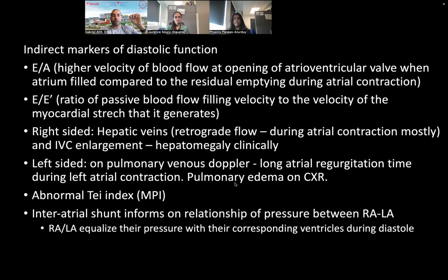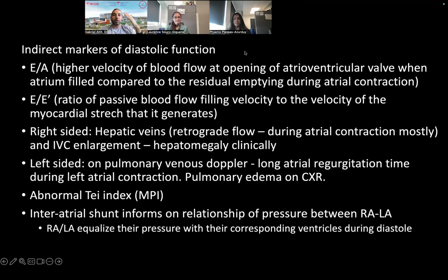So Laurence, I think there are some questions in your exams about tamponade physiology, and as a future neonatal hemodynamic specialist, it's something that you need to recognize. What's the difference between a pericardial effusion that has no consequences or is physiologically sound, and one that you think is having a tamponade effect. If the patient is stable, then obviously it's an immediate discussion with your cardiologist to discuss whether this patient will need a drainage. If your patient becomes hemodynamically unstable, then you need to go and drain, especially if they are on the verge of going into cardiac arrest. It's an emergency procedure.